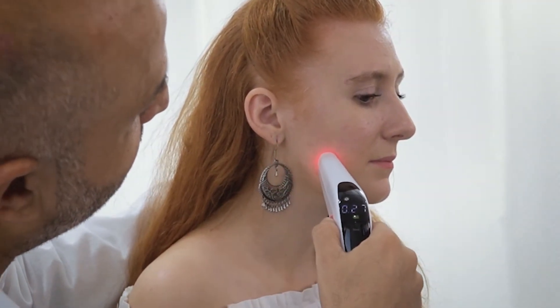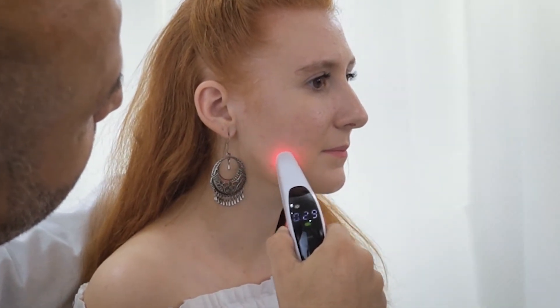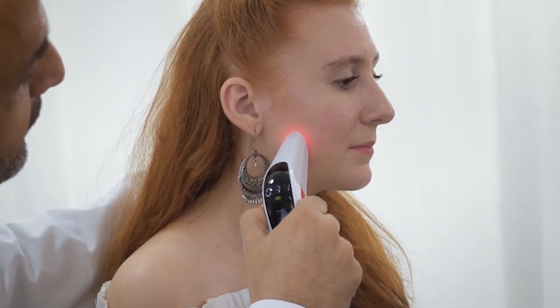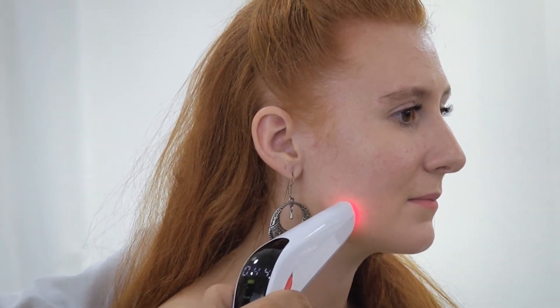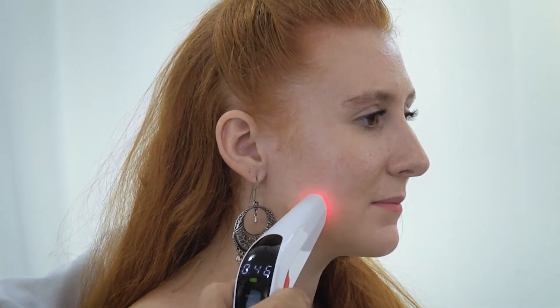Keep adjusting the intensity of biostimulation during the entire treatment session to ensure the patient's comfort. Continue the treatment for 10 to 15 minutes depending on the severity of the condition to get the best results.